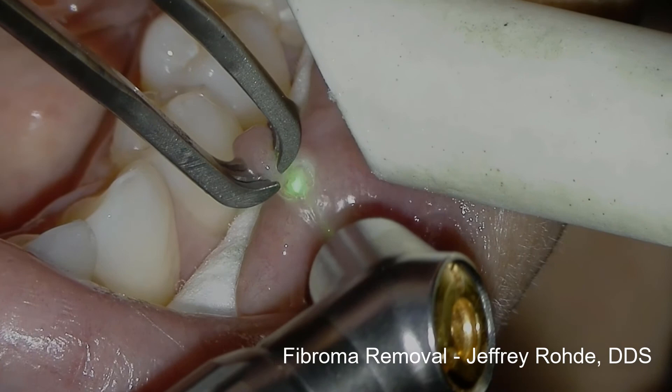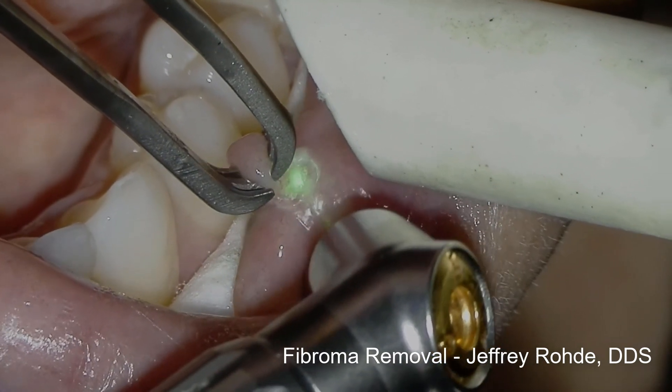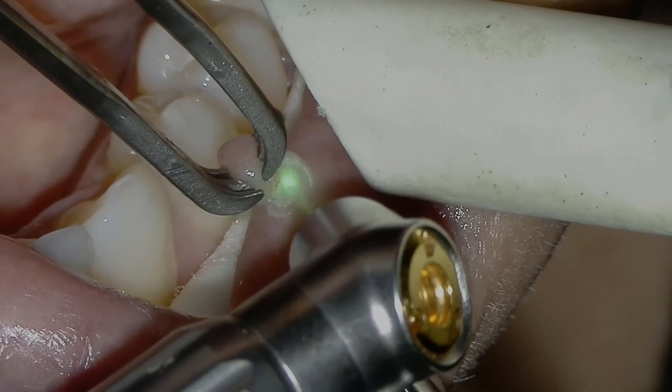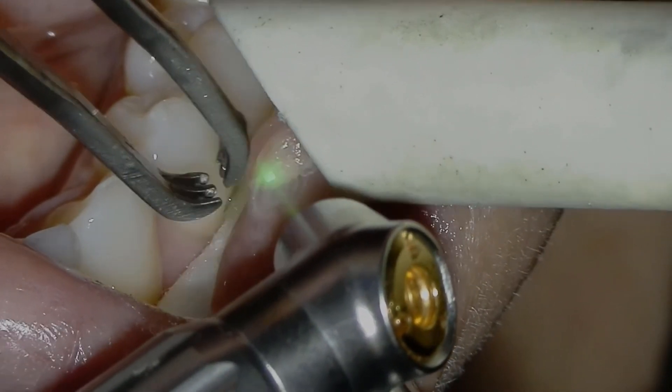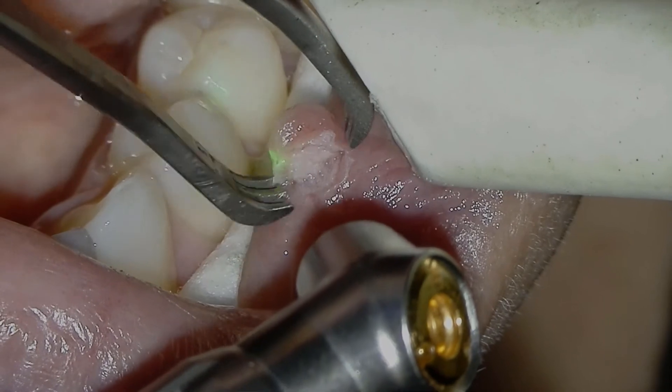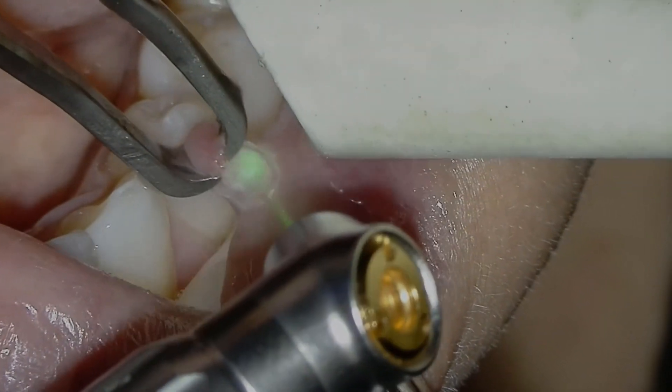This fibroma removal was performed blood-free and in less than 60 seconds. Following application of topical anesthetic, the tissue is elevated and gently pulled forward using forceps. The patient reported no post-operative pain and exceptional tissue healing was observed.